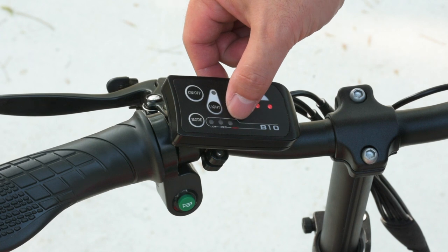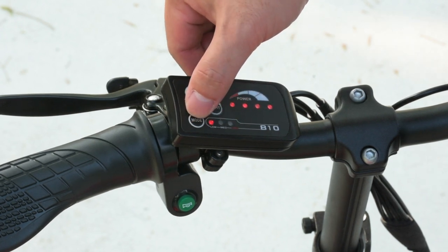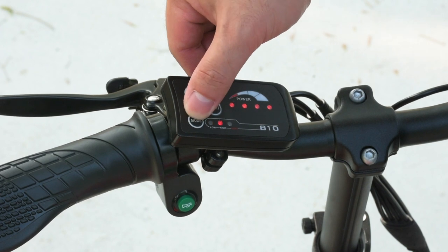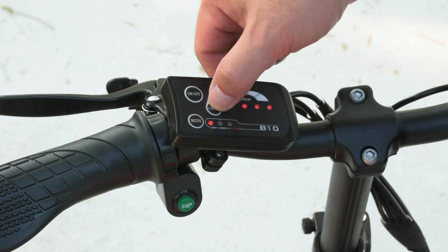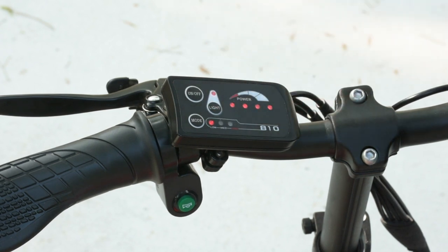Pressing the on/off button turns on the Flexi Pro. The default setting when first turned on is always neutral, which means it won't move when the throttle is engaged. The speed setting can be changed using the mode button. There is also a power meter indicating how much battery is left. The button with the light icon toggles the headlights on and off, and the green button at the bottom sounds the horn.